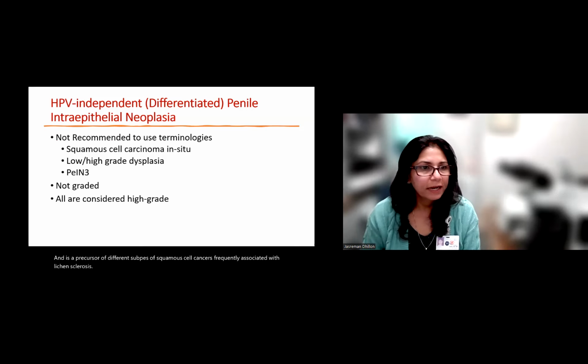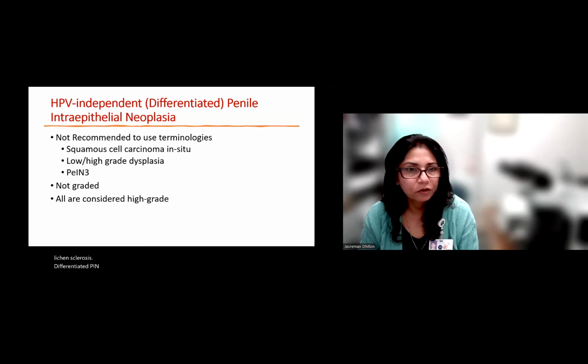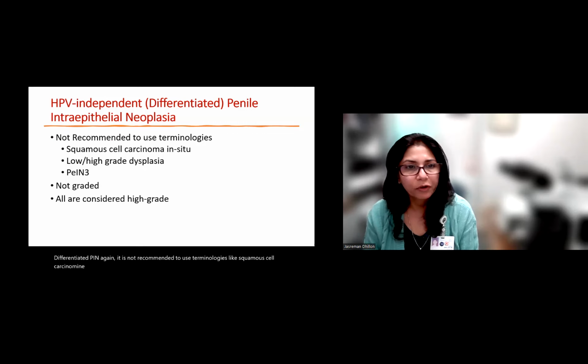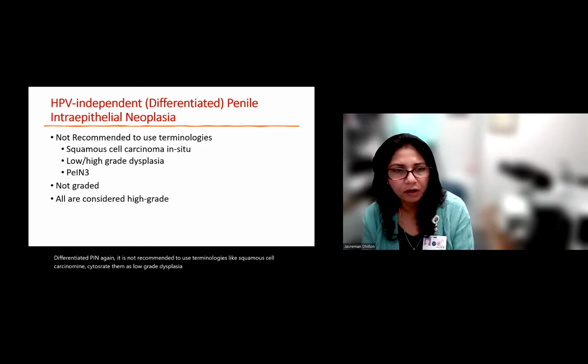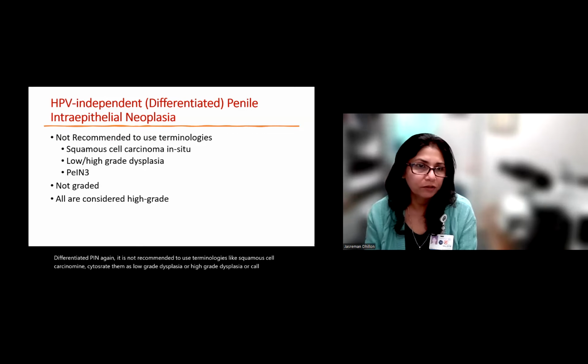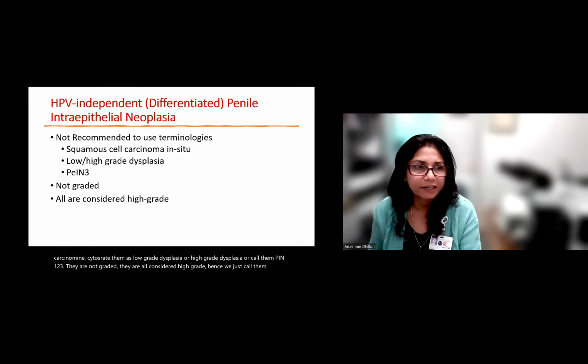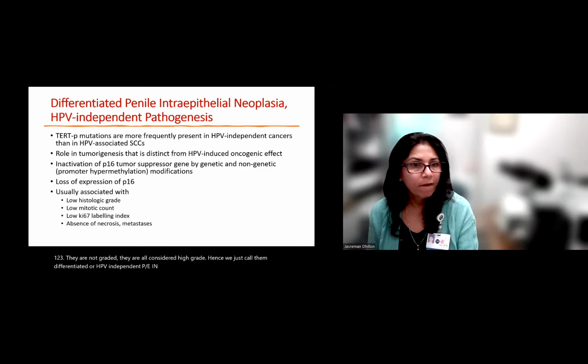Now, differentiated PIN, again, it is not recommended to use terminologies like squamous cell carcinoma in situ or to grade them as low-grade dysplasia or high-grade dysplasia or call them PIN 1, 2, 3. They are not graded. They are all considered high-grade. Hence, we just call them differentiated or HPV-independent PEINs.